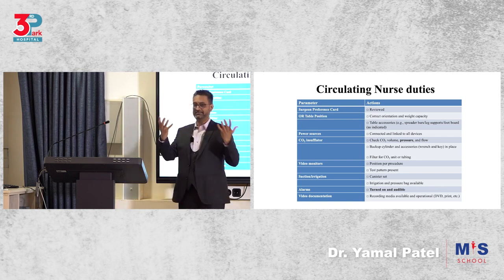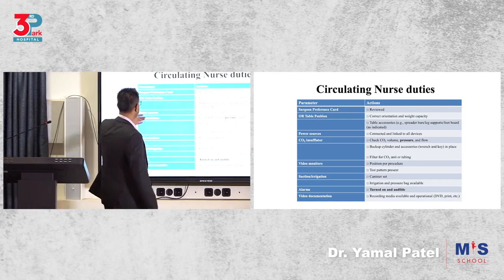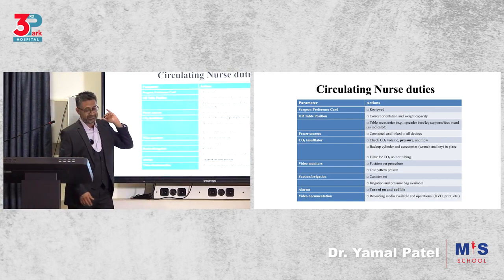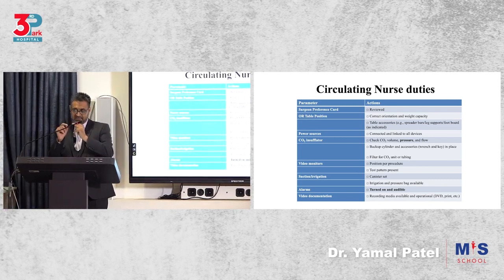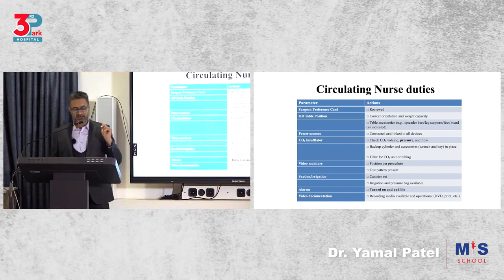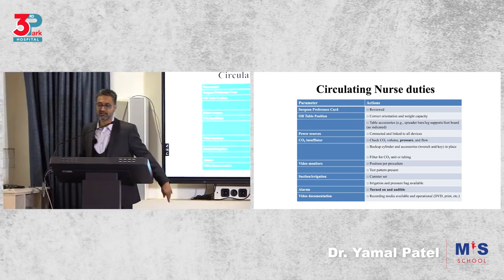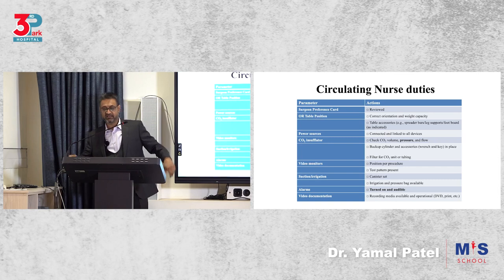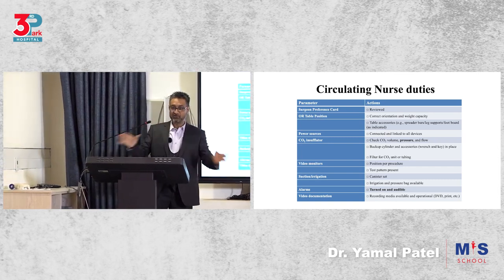And I told you, work as a team. Have a safety checklist that is developed in your theater. And it could be something like this. Is there a surgeon preference card? Did I check what he needed? Yes, tick, done. Is the OR position correct, table correct? Yes, it is flat, the height is okay, the accessories, the supports are there, the anti-slip is there. You get what I'm saying? You've done everything.